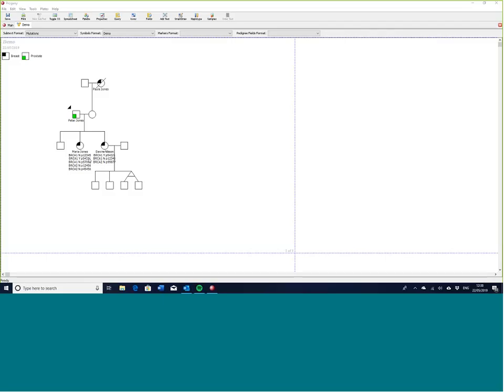So if you look, you've got some icons for different cancers, as you can see. You've got the first name, last name, and you've also then got the mutations that have been screened for in this particular patient. Now, as you can imagine, for Maria here, for example, she's had 5 screens, pulled up 5 variants, of which only one is pathogenic.